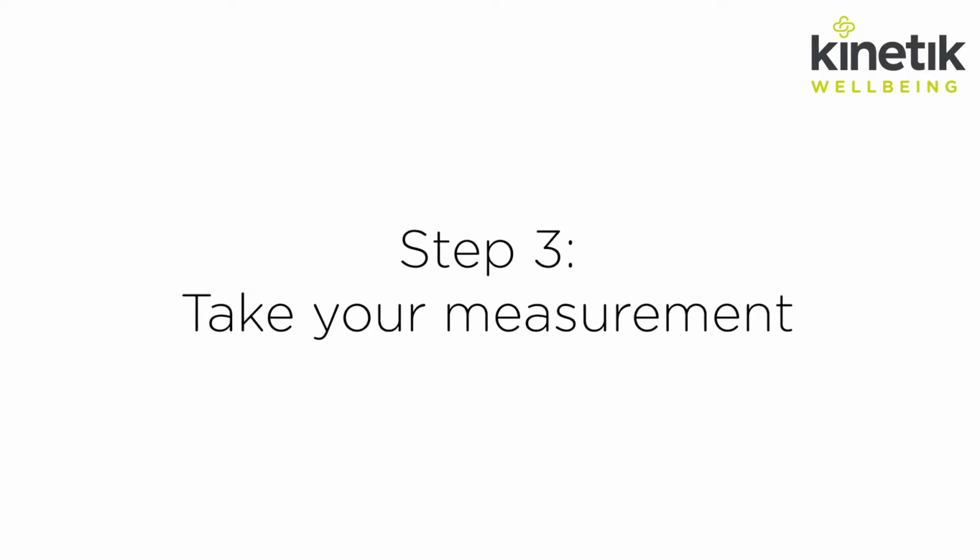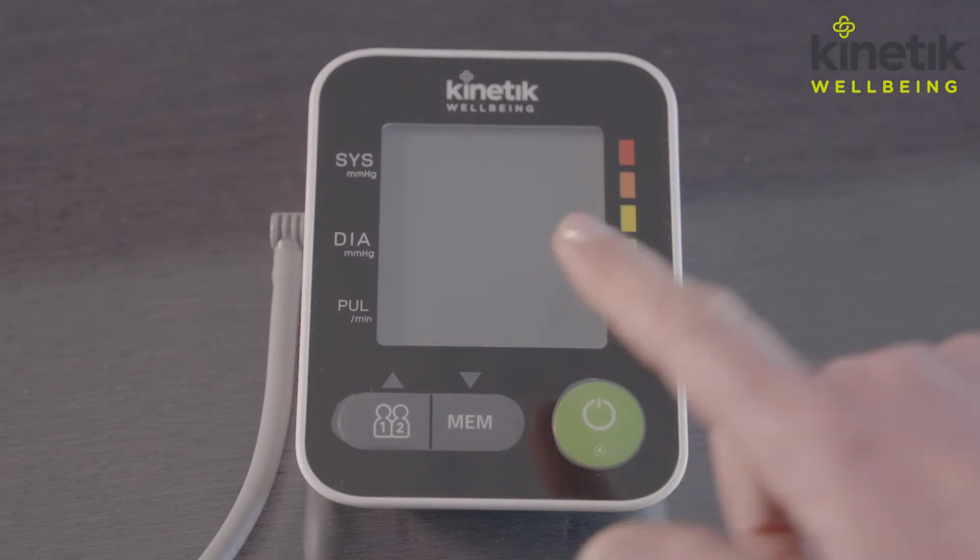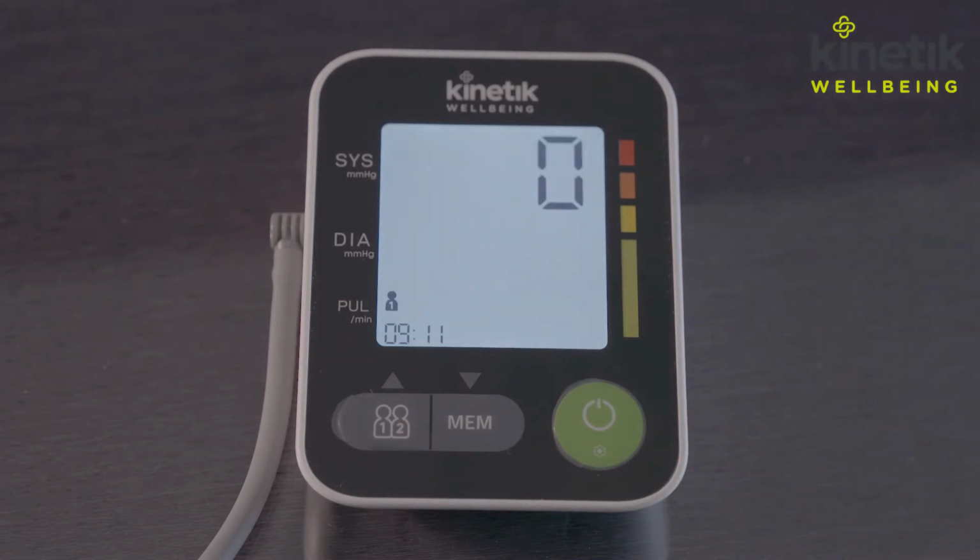Step 3. Take your measurement. Select user and press start. Don't talk and relax as the cuff inflates.